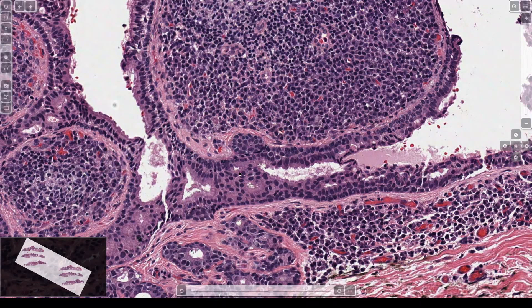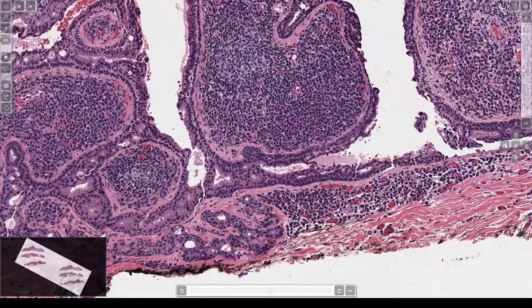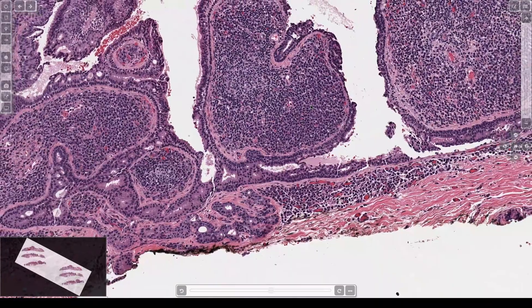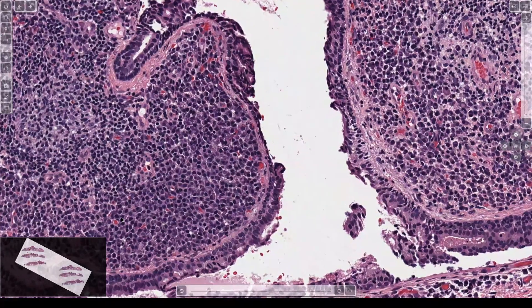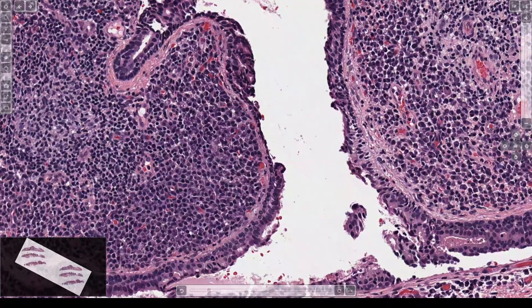So when you see this, it's a strong indication you're dealing with some sort of a sweat gland tumor. And look at all of this inflammation packed in the middle here. What are these cells mostly? Plasma cells — loads of plasma cells in this lesion.